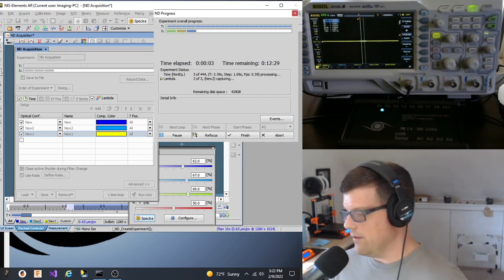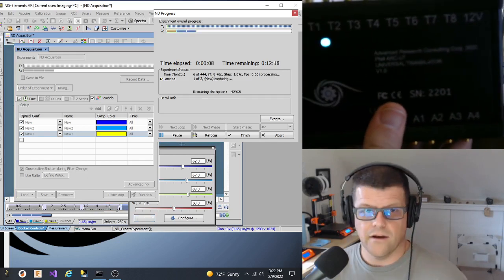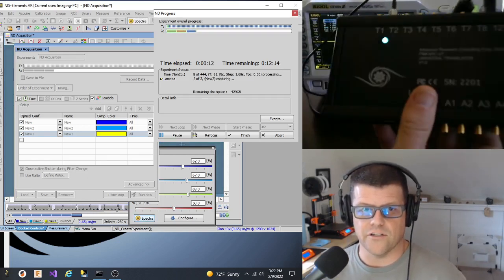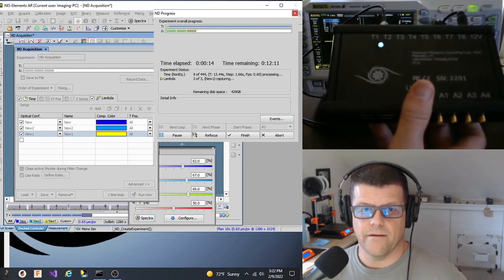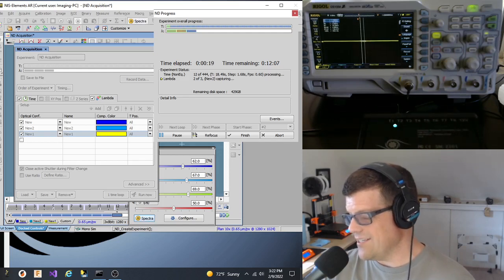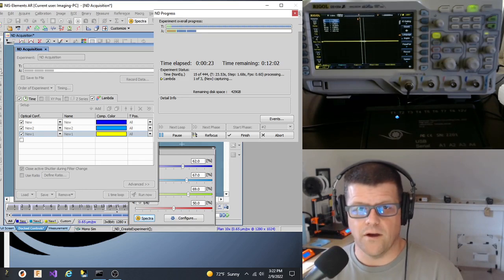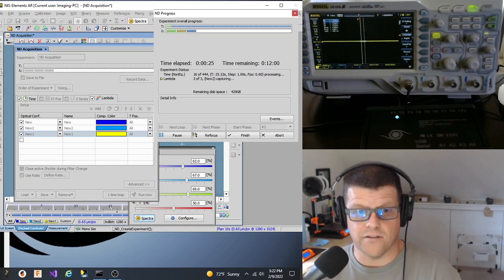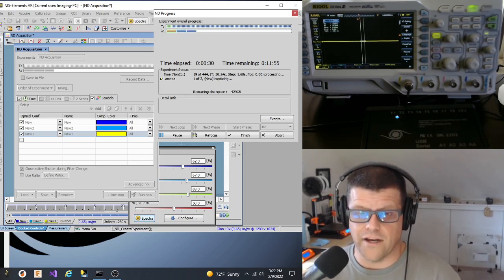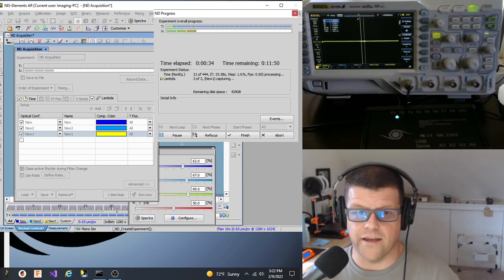and we can see that the LED channel is switching. Now there is a delay in doing this because you do have to talk between, here's just the different colors. It's kind of hard to see. The camera doesn't do it justice. There is a delay between communication. That delay tends to be between 5 and 15 milliseconds. So for most people, that won't be enough to matter, especially when you're considering that you either aren't able to control the device or it's very difficult to control the device versus being able to with a slight delay.